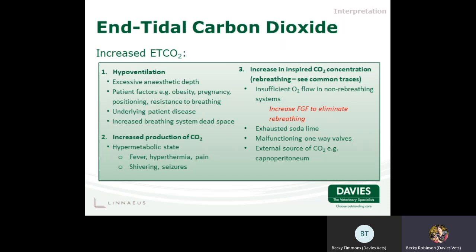However, an increased end-tidal carbon dioxide level can also occur due to an increased production of carbon dioxide. So that is an increased metabolism. For example, a patient with fever or who's shivering. Or it can also occur as a result of an increase in the inspired concentration of carbon dioxide. That is with rebreathing, as we've already touched upon.